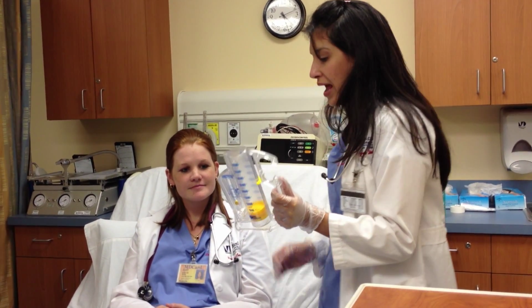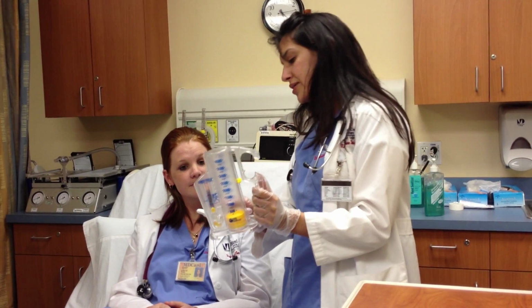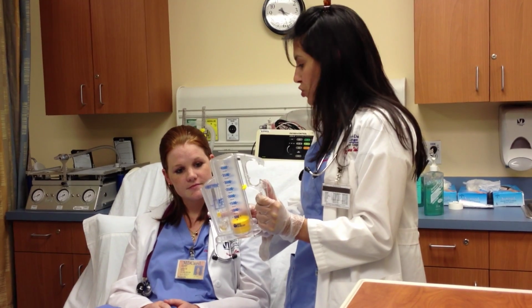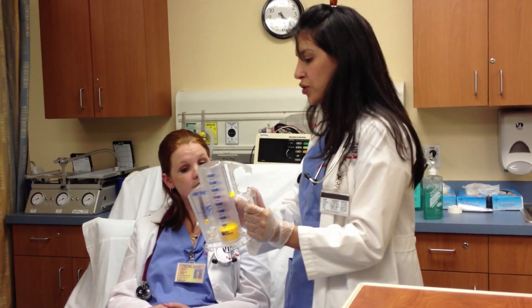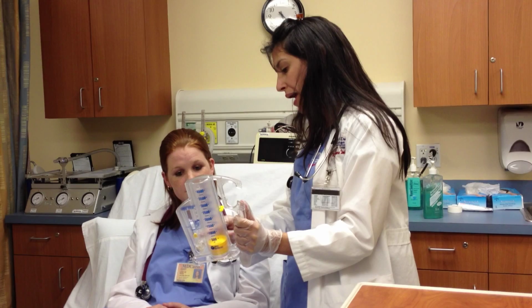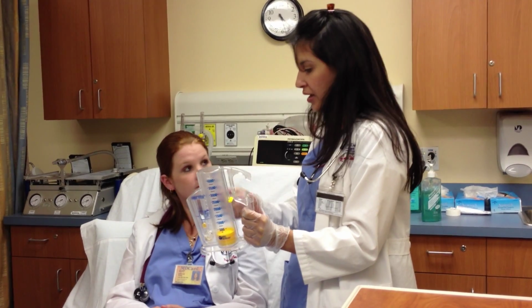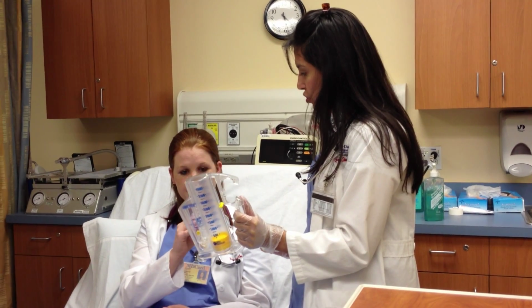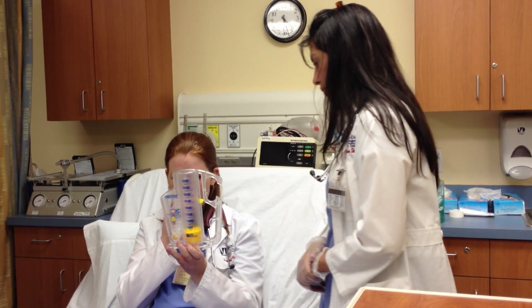Great job. Now, this is called an inspiratory coach. This yellow indicator, while you're inhaling, I need you to keep it in the happy face. You see there's two unhappy faces? While you're inhaling, I need you to keep it in the happy face. Okay? Will you be able to try that now? Yes. Thank you.